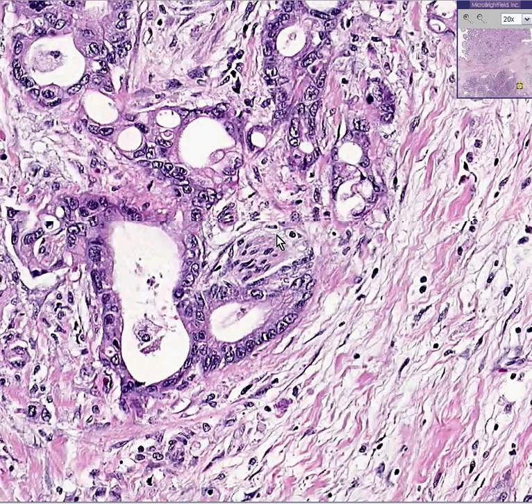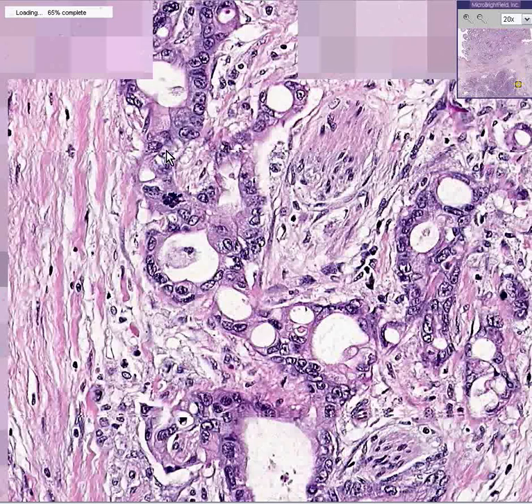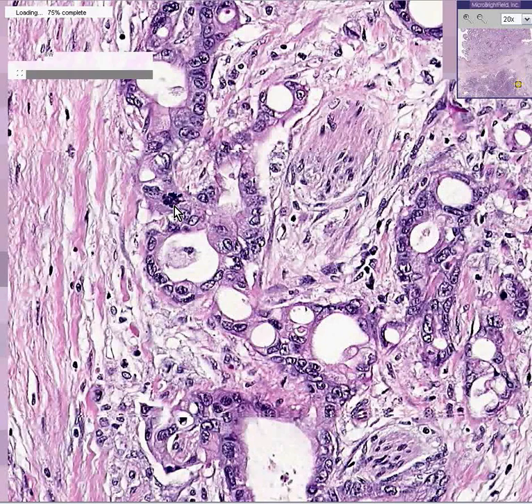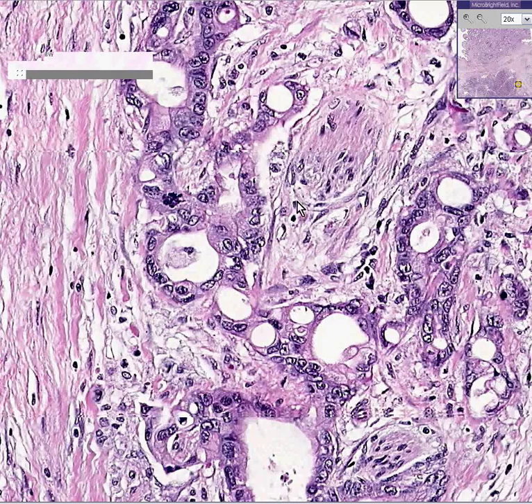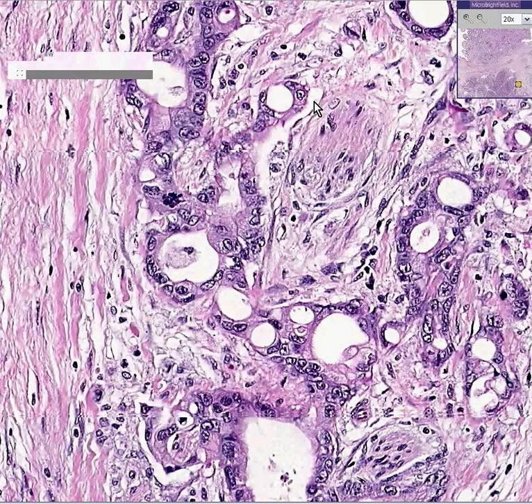In addition, look at these dark irregular cells. Here's an abnormal mitosis — that's almost diagnostic of malignancy. And here's another nerve, and perhaps there's some sclerosis around it. Whether you think that this little glandular cluster here is growing directly into the nerve sheath — I think it is. So if you agree with me, that would make you right, wouldn't it? Thank you very much. Infiltrating adenocarcinoma of the pancreas.